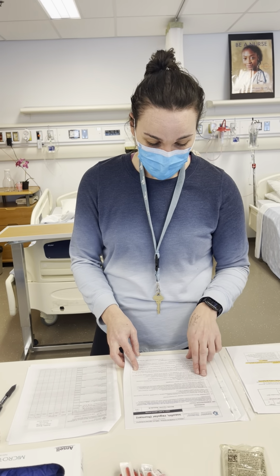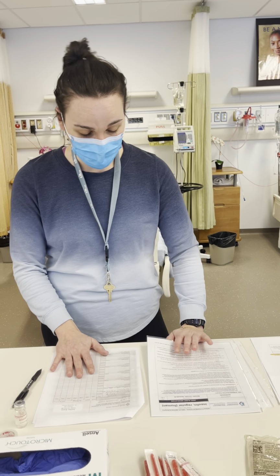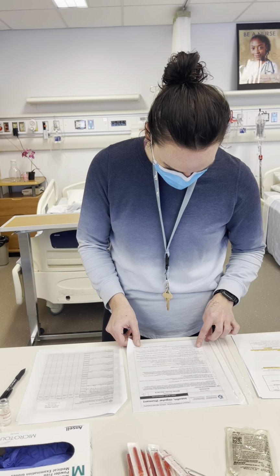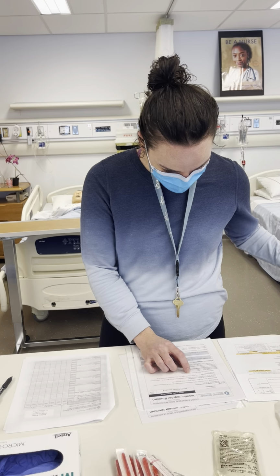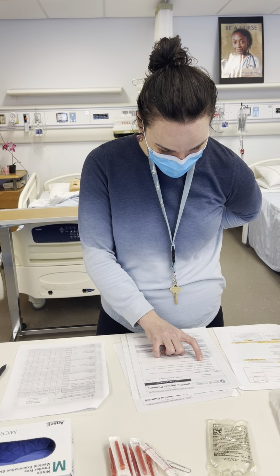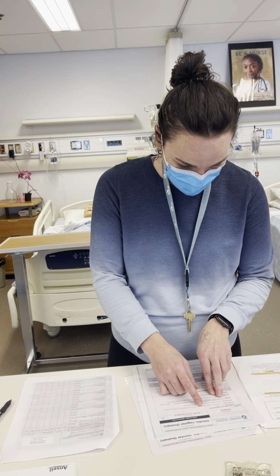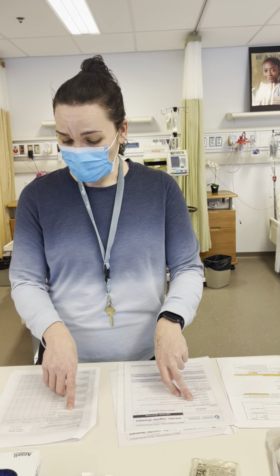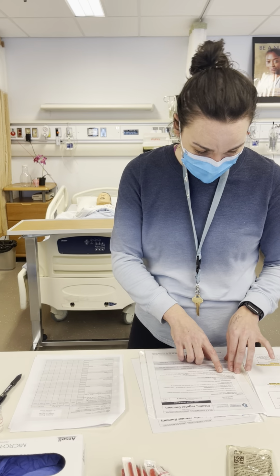And we want to make sure that we have D50W ready on the unit, just in case they have a hypoglycemic episode. So IV continuous, sorry. We've got 10 units per hour being in the safe range. So our doctor ordered 2 units per hour, so we're in the safe range.